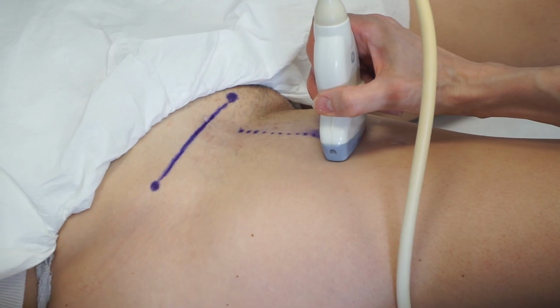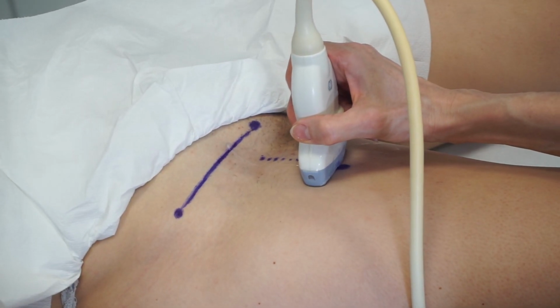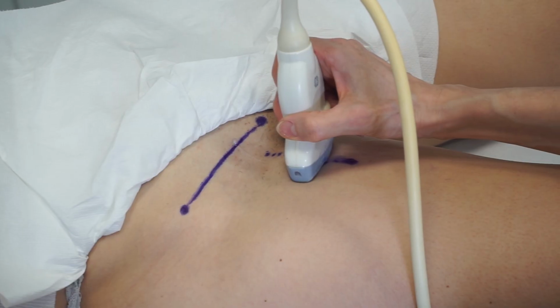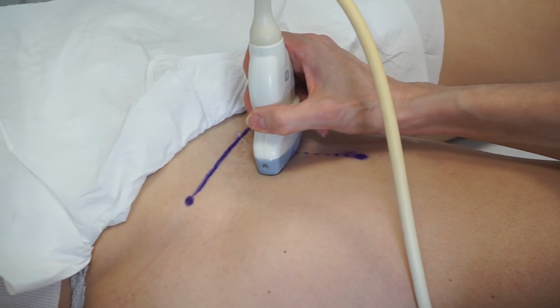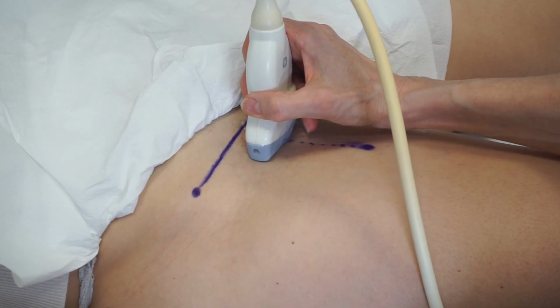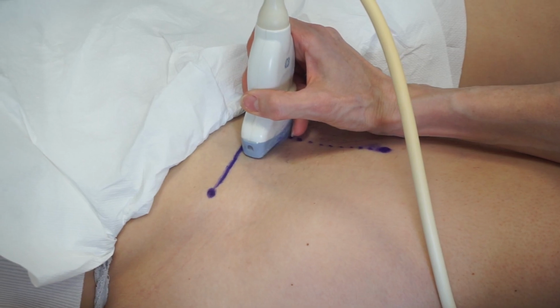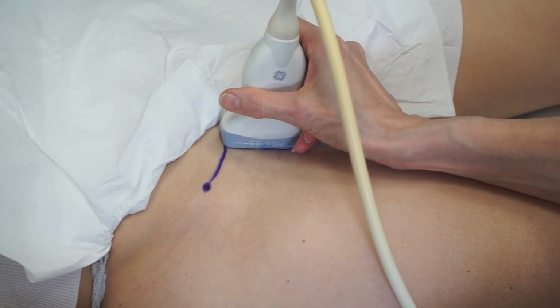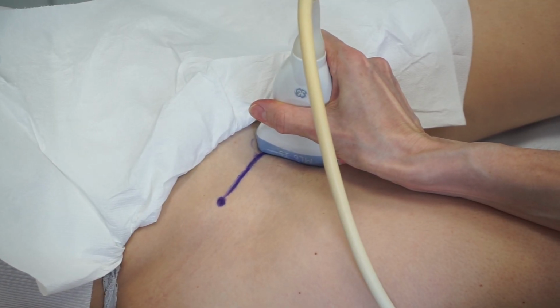The probe is positioned at the apex of the femoral triangle in the transverse plane and moved cranially along the femoral vessels up to the inguinal ligament. The probe is then rotated in the oblique plane to obtain a longitudinal view of the vessels.